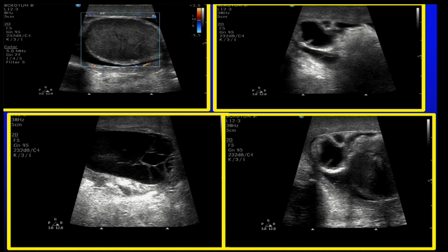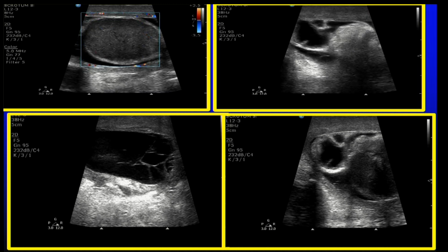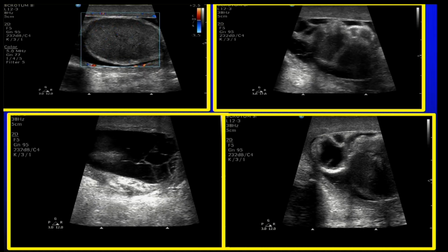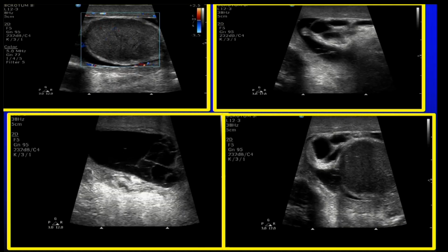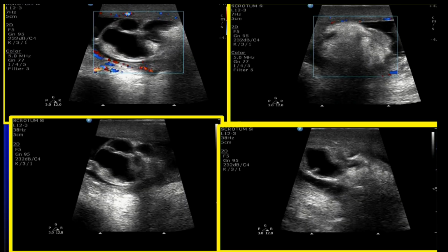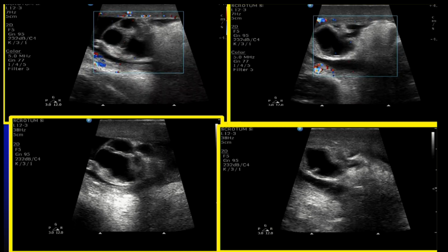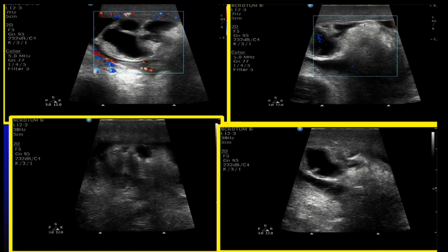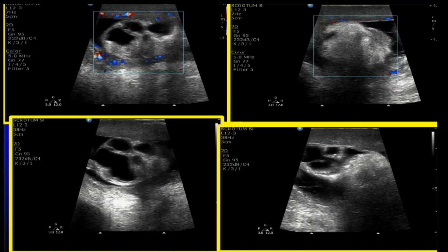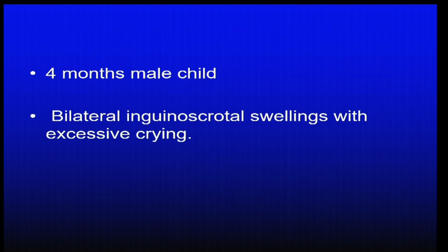As against that, in one case we had torsion of the testes, but at the superior pole, at the region of the epididymis, I saw this echogenic cystic structure, inhomogeneous like this. I was wondering, I have picked up torsion, what this could be. And I told the surgeon that area is looking like epididymis. Could this be epididymal torsion? And it indeed turned out to be so, that the testes and epididymis both had twisted on their own, and this was the follow-up.